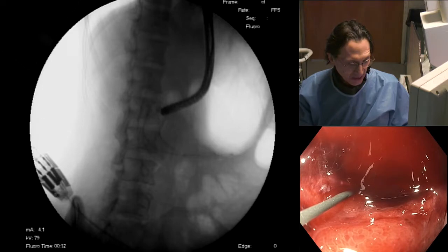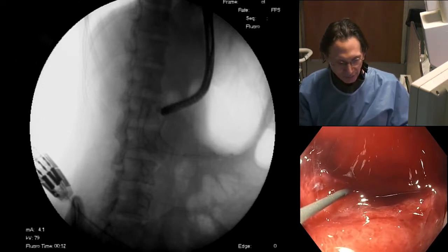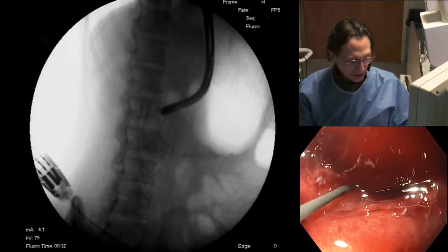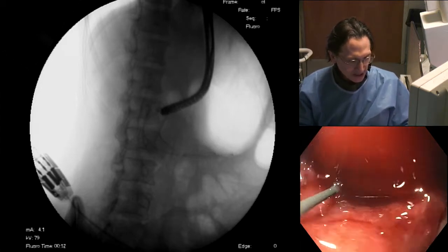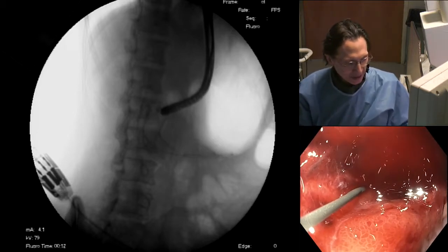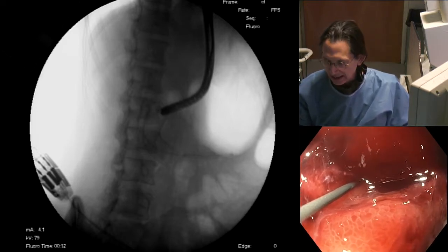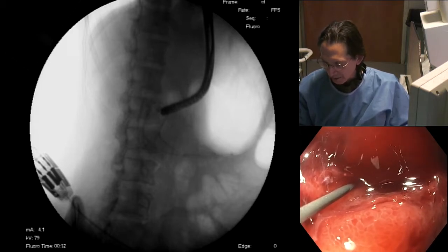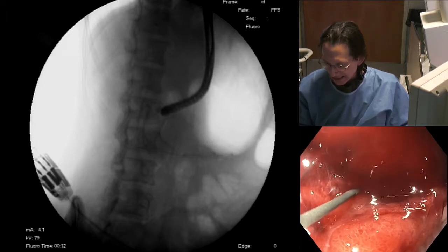Now, of course, we could place another metal stent through this. It could be a fully covered stent. I'm just very concerned that this is not going to give her sufficient relief of her gastric outlet obstruction, because the lumen will be narrow already. She's got 2 stents in there, right? And by placing a third stent, I don't think it's going to open up sufficiently for her to get at least the best quality of life that we can offer. And I think the best quality of life will be an enteric bypass, a gastrojejunostomy.